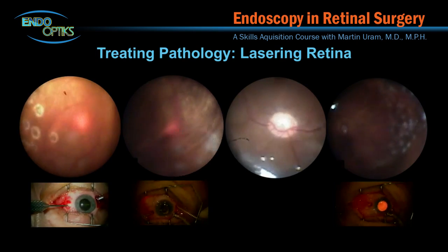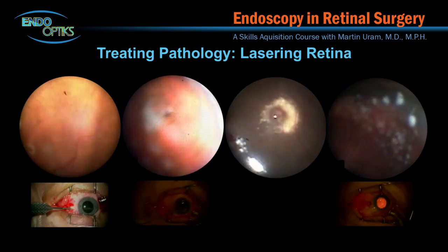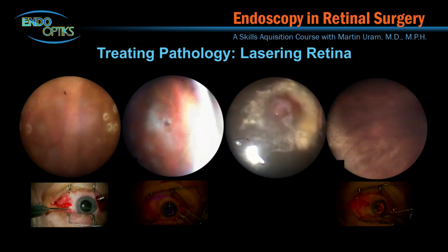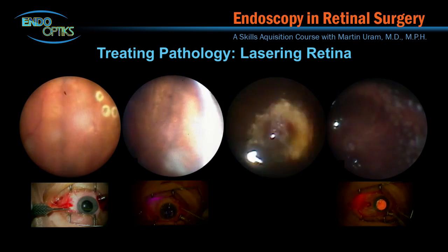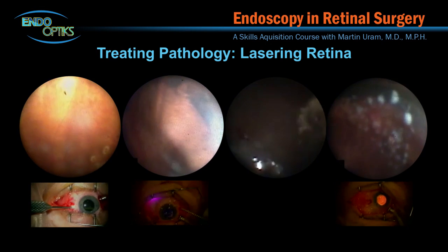Perhaps the most useful one-handed technique is the endoscopic delivery of laser energy. It is much easier to laser through the endoscope than through the operating microscope, even when a good view is available through the latter. As application of laser proceeds more peripherally, it is technically easier to perform by one hand endoscopically than two hands microscopically.